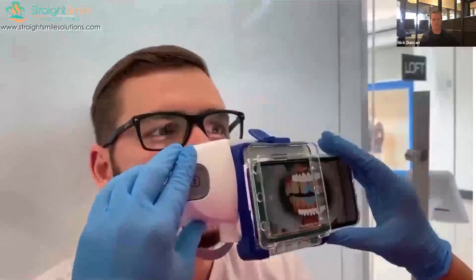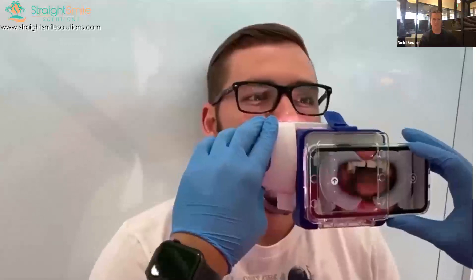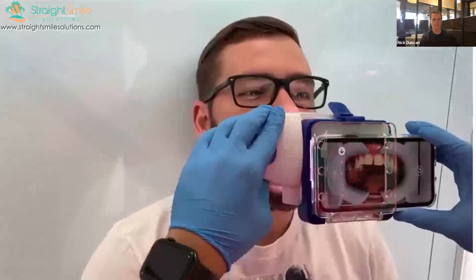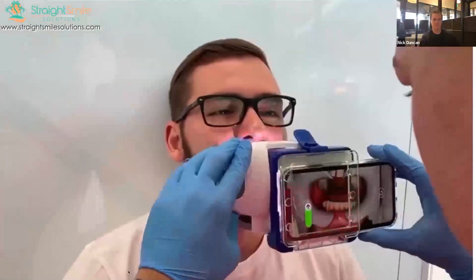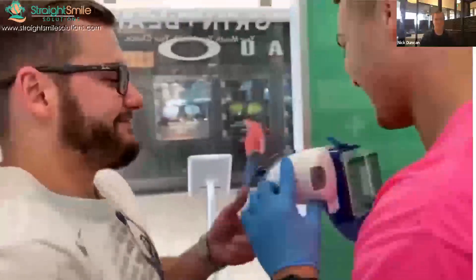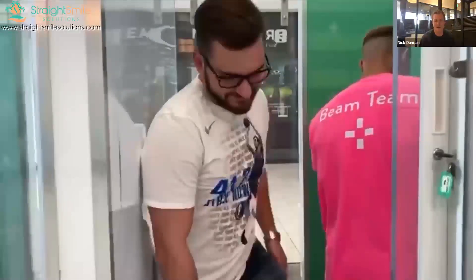For this next step you'll have to open wide and scan up and down — double tap to continue. Open your mouth as wide as you can and tilt the scan box up. That's the process of actually capturing the scan.